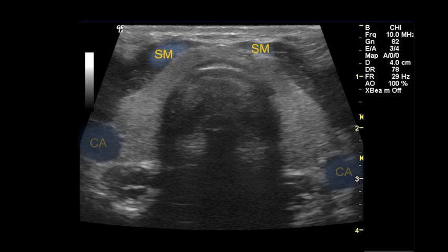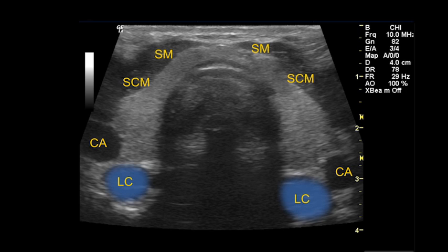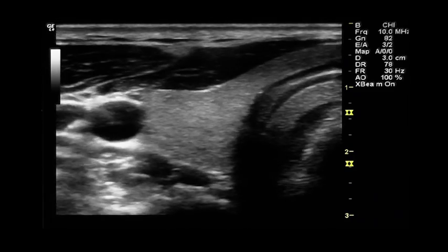This image demonstrates that the thyroid gland is bordered anteriorly by the strap muscles and laterally by the carotid artery and sternocleidomastoid muscle. Posteriorly, the thyroid is bordered by the longus colli muscles. The thyroid gland is more echogenic than the adjacent muscles and blood vessels.